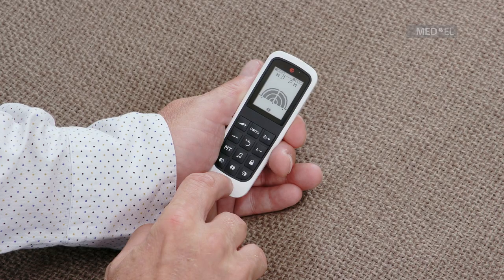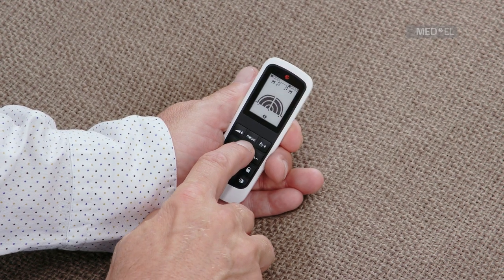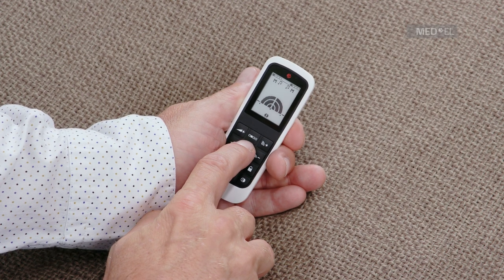The default key sets volume and sensitivity back to predefined values set by your audiologist. Pressing default will not change your program.